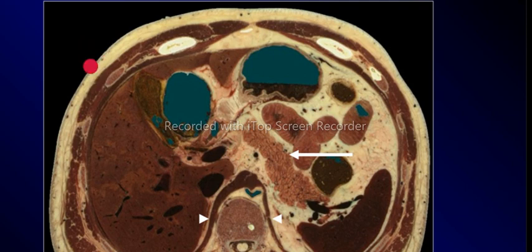And you will see that the liver is getting smaller. The liver is widest towards the right side and superiorly. As we go down, it gets smaller. As we go to the left, it gets smaller. And then here, this is your caudate process, caudate lobe there. This is your IVC. Mesenteric fat, which is the yellow all around there. Muscles of the anterior abdominal wall and back. Then you have subcutaneous fat and skin.